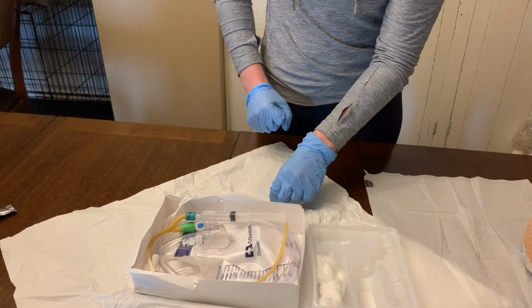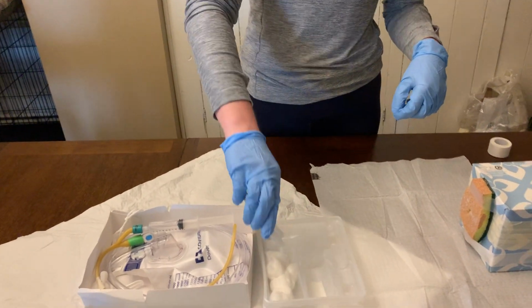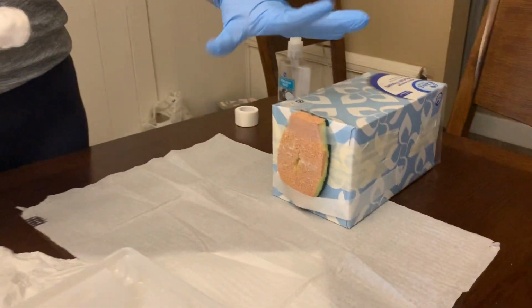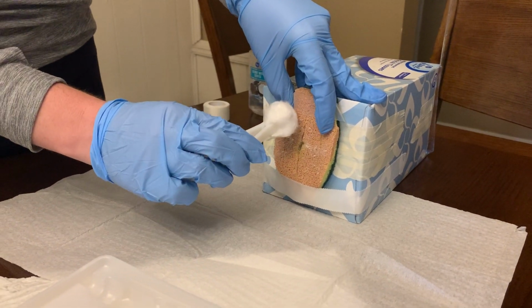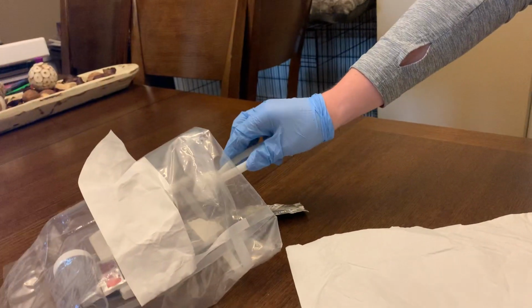Okay, so now I will start cleaning the patient's perineal area. I'm going to pick up one cotton ball, and then once I place this hand, it is contaminated, so I will not be moving it. I'm going to spread the labia, and I'm going to clean top to bottom on one side, and then I will discard that.